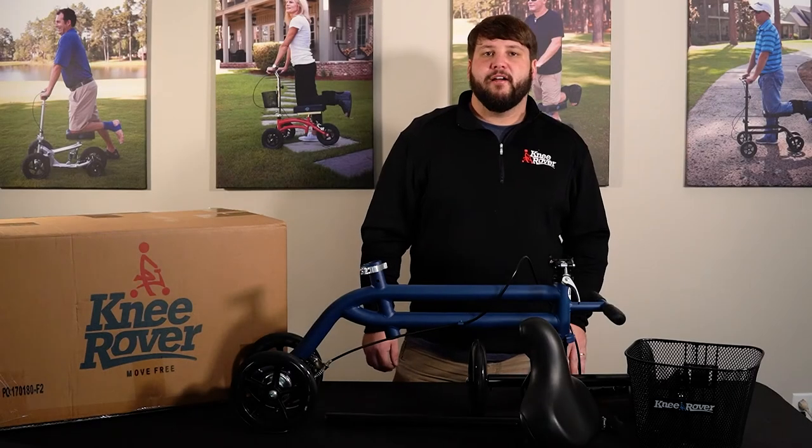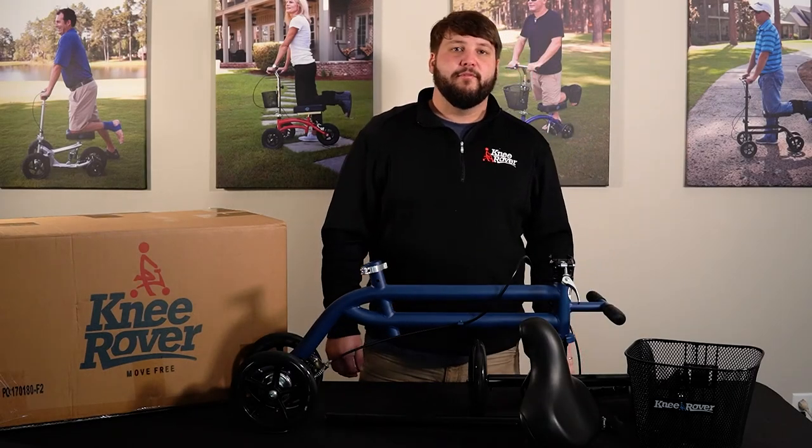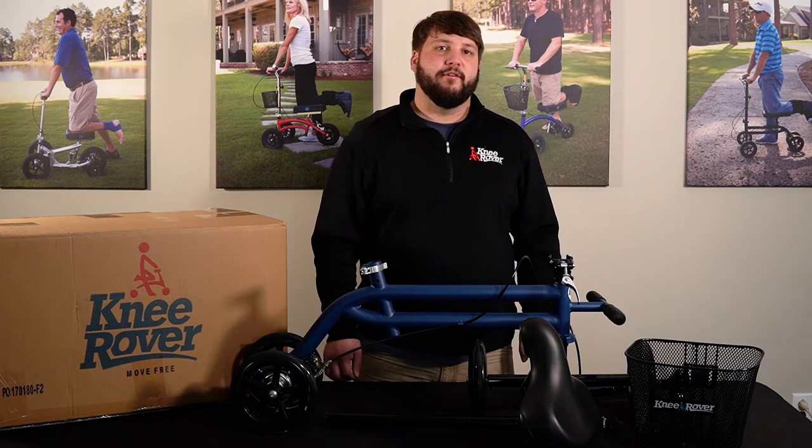Hey, Justin here from KneeRover.com, and today we're going to assemble your Evolution Seated Knee Scooter.